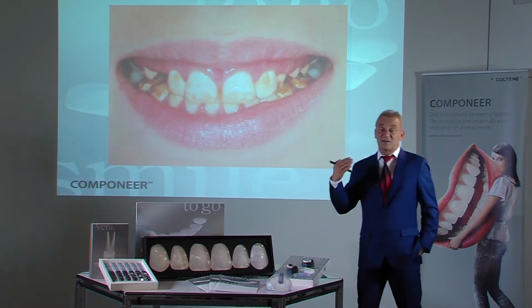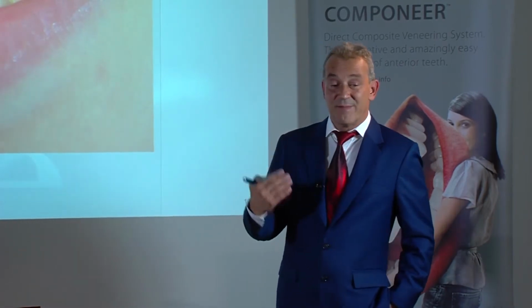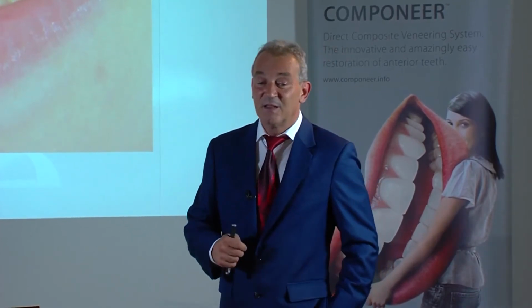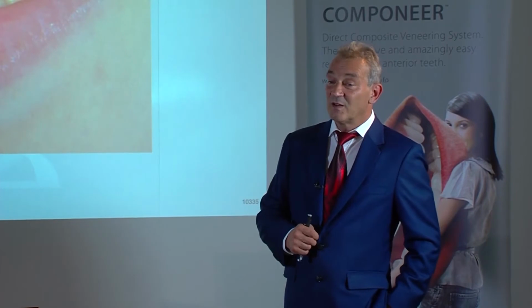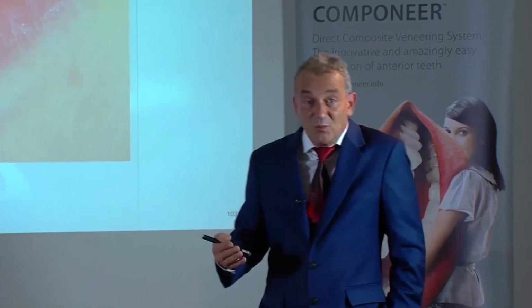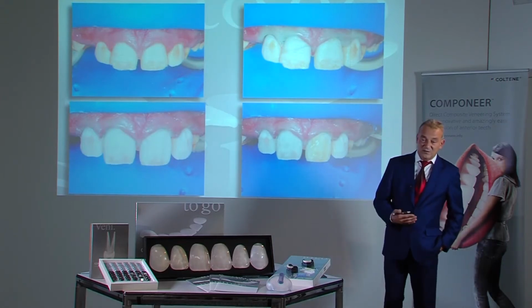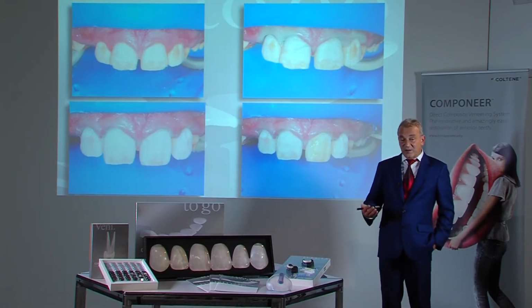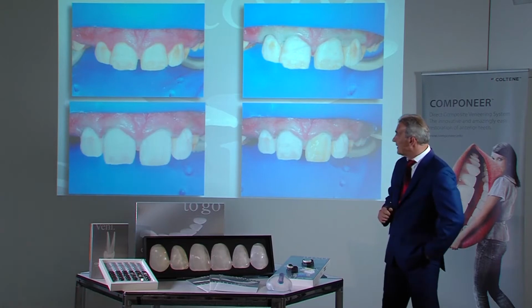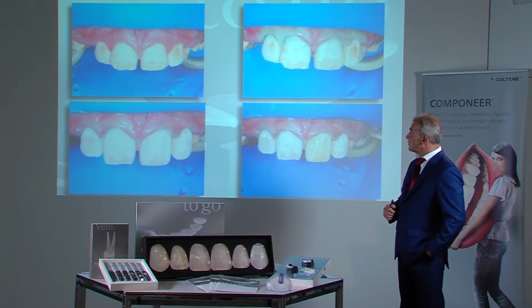From the literature, we are aware that etching and bonding to dysplastic enamel is not 100%. But in this case, we did not have an alternative. Maybe adhesion will be a little less, but we have no choice. Time is often a crucial element with children. With this 10-year-old girl, it can be expected that she will become restless after 1 hour and that her level of cooperation will drop. Therefore, treatment needs to be fairly quick.